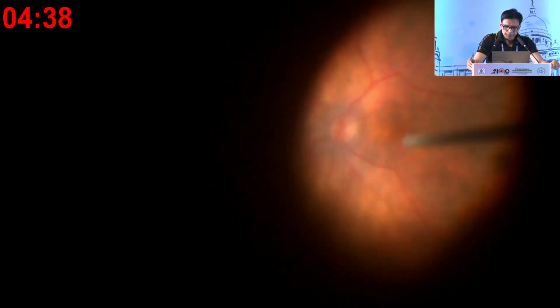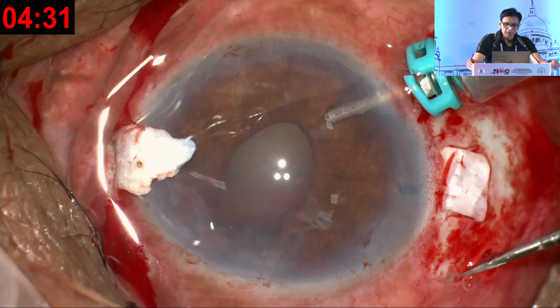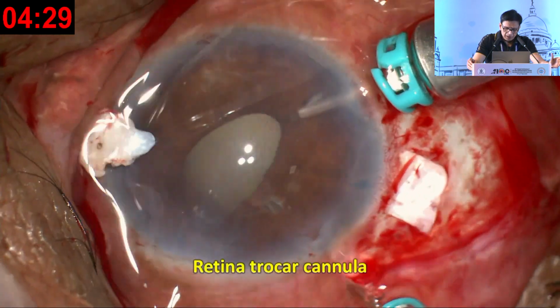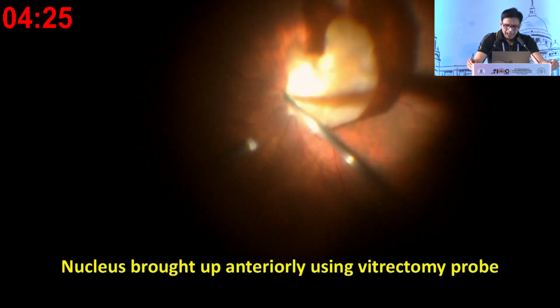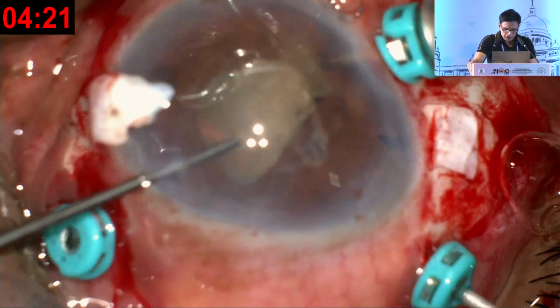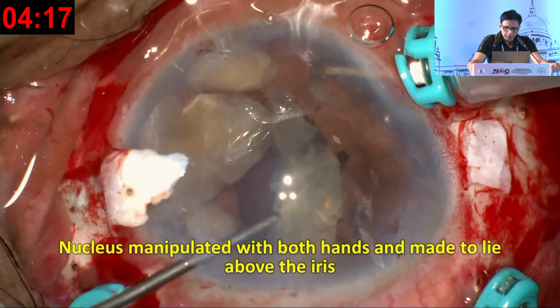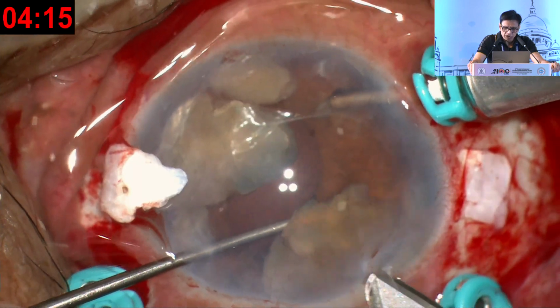Once both sides are done, I'm going to go in and do my vitrectomy there and trying to search where that nucleus piece is. And lo and behold, you see that fragment is lying in the peripheral retina. I fixed now my retina trocar and I brought those fragment to the above the disc. Using suction, I'm just bringing it up after vitrectomy. Once I brought it up anteriorly, again I will use the scaffold technique.